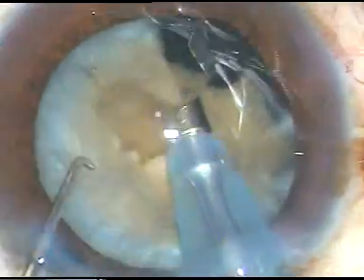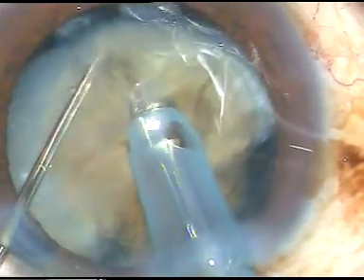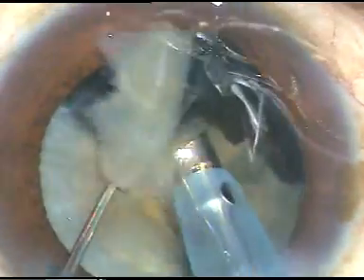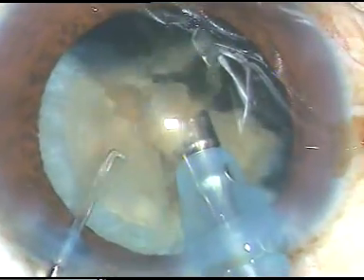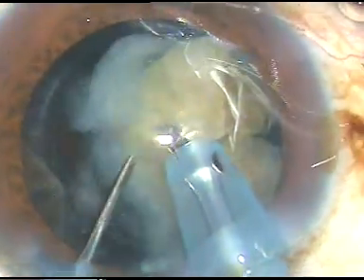The vacuum is very nice. I hold the nucleus firmly and chop. Each fragment is worked on with ultrasonic energy, emulsified and removed.